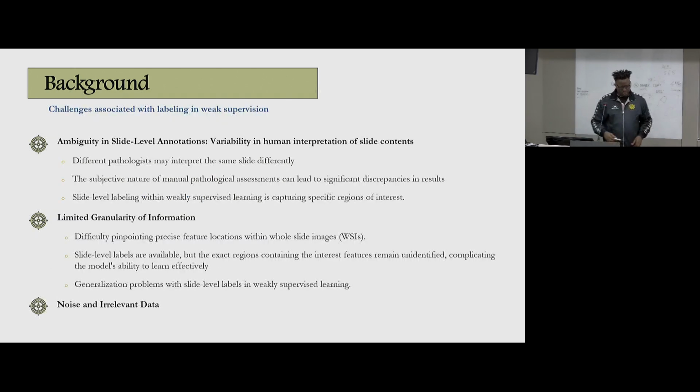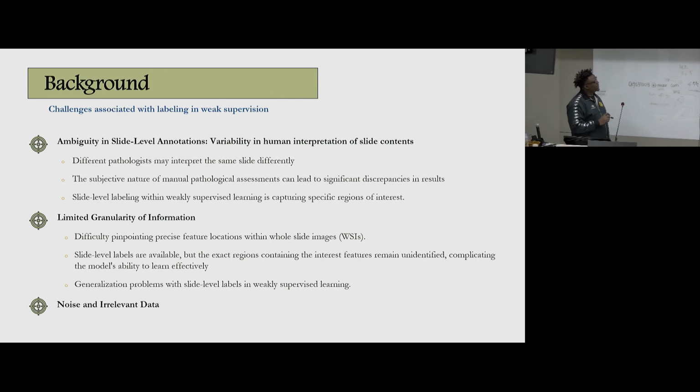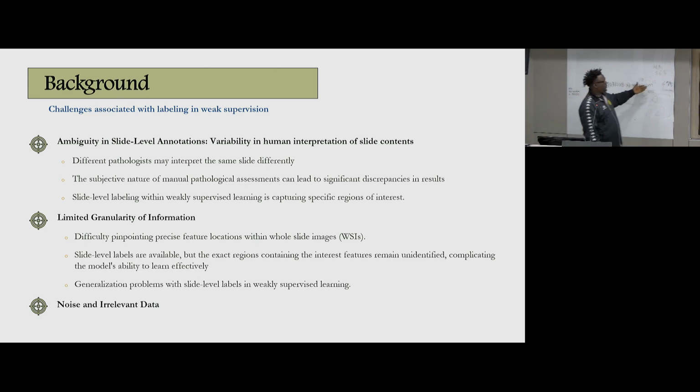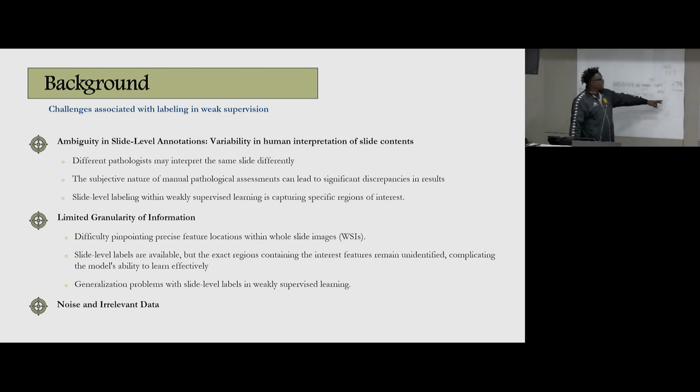But when you engage in weakly supervised learning, you have to understand there are some very big issues. I was just talking about the slide level, but you understand what it is already. This is the annotation we give to this slide, and it can be very subjective. Just imagine this pathologist came and annotated here, and he gave this slide necrosis.